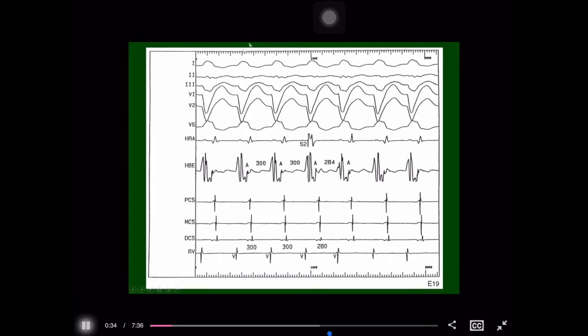During tachycardia, we introduce a premature atrial complex from somewhere in the right atrium and we perturb the tachycardia a little bit. I actually have all those numbers on the tracing. If you look at the tracing, you have the A to A interval in the septum area, 300 milliseconds and also 300 milliseconds when you put in your premature atrial complex.